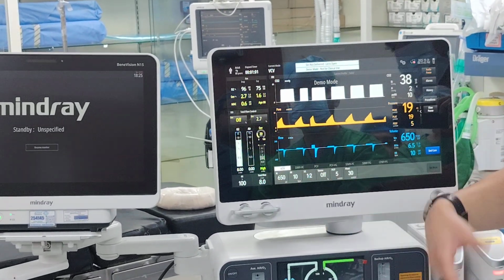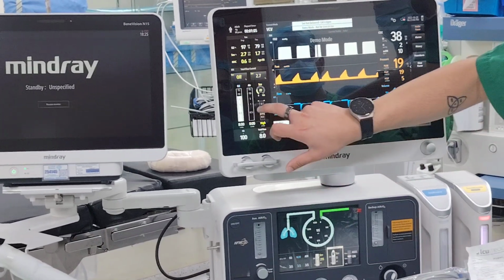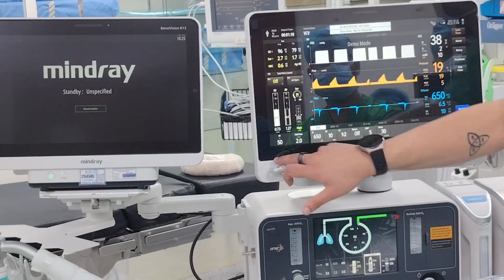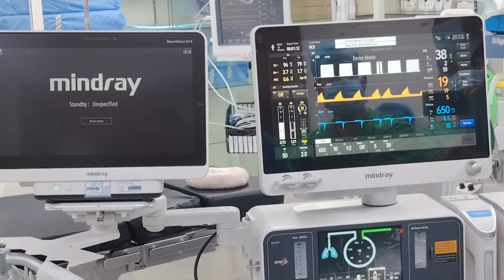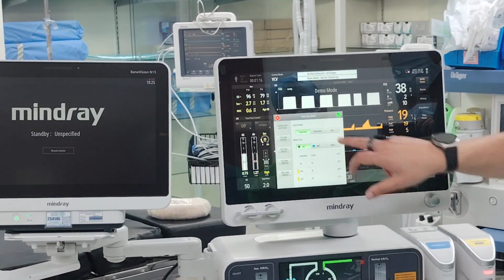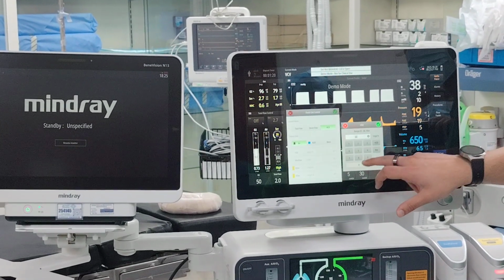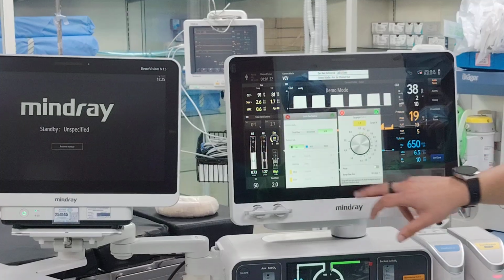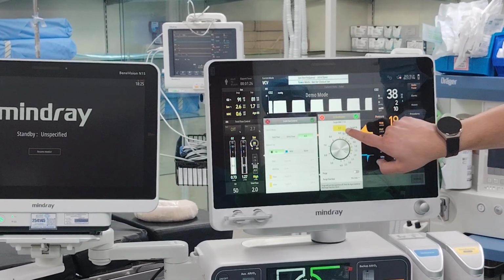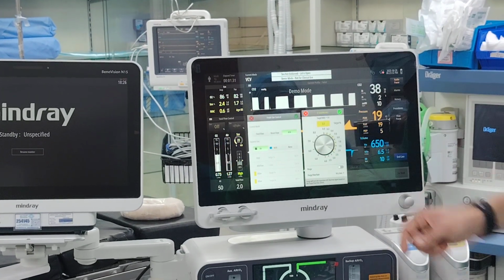Okay? So next I want to go to low flow. Two ways. You want the basic, you can click here, go 2 liters for example. See 2 liters 50, you can change as you would like. I would encourage you to use the cruise control. So what you do is click here, ACA. I want the target, for example, 60% on my patient side always. I want the Sevo, for example, MAC to 1.4. You see up, which is equivalent to 2.2 for an 88-year-old person.